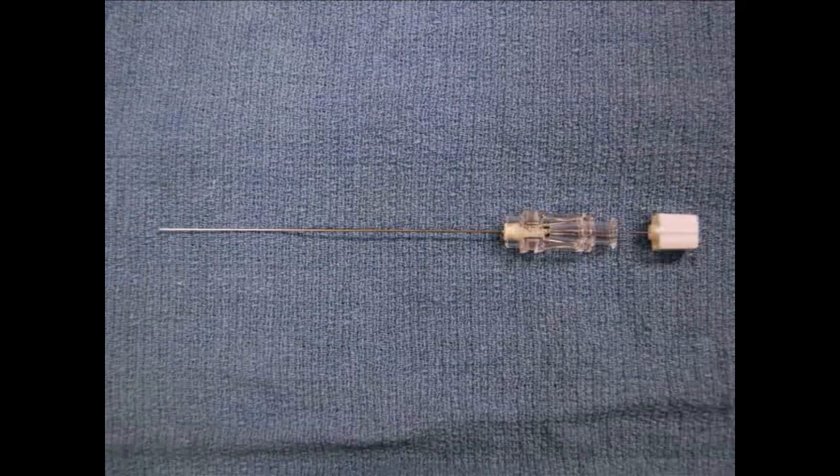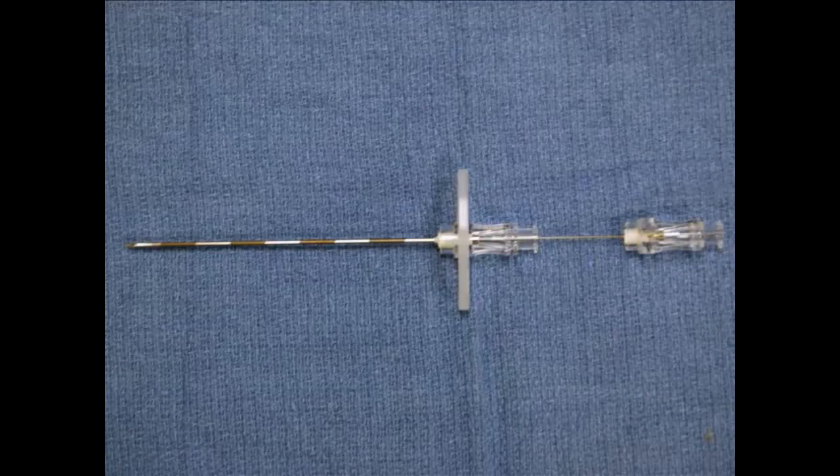Here we use a 24-gauge, 124-millimeter pencil-point spinal needle. Ensure that the spinal needle slides easily through the Tuohy needle. When the hub of the spinal needle is flush with the hub of the Tuohy needle, the spinal needle tip should extend past the tip of the Tuohy needle.